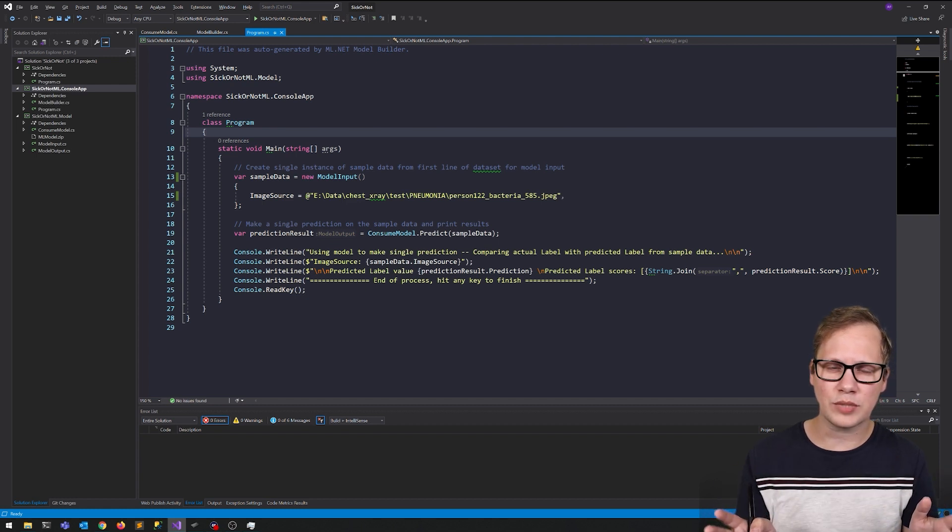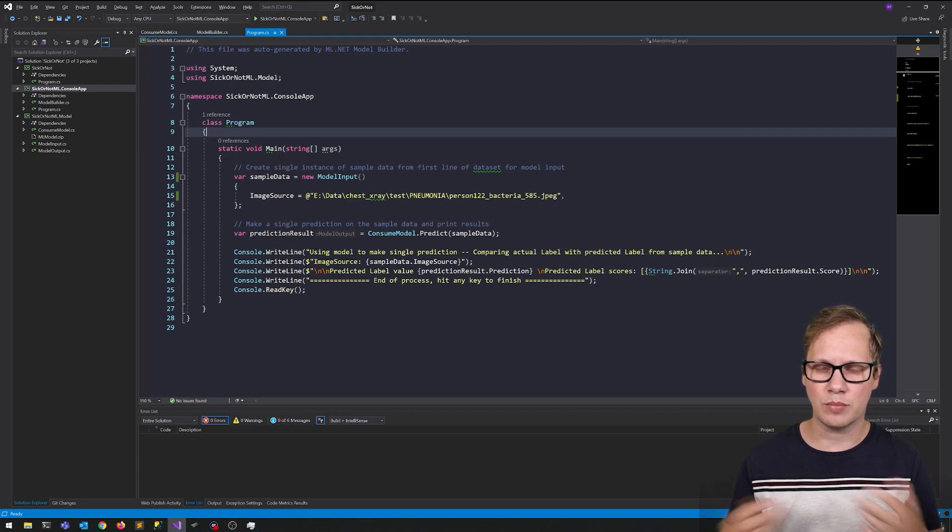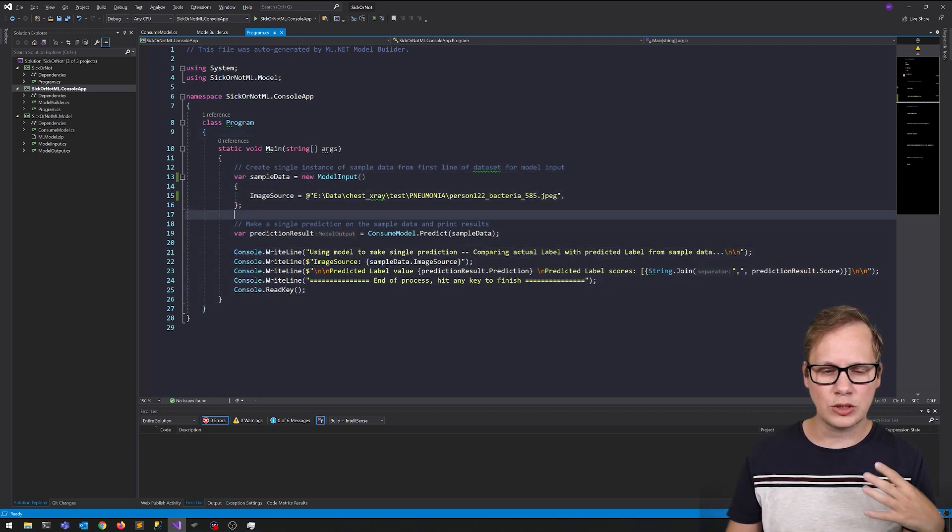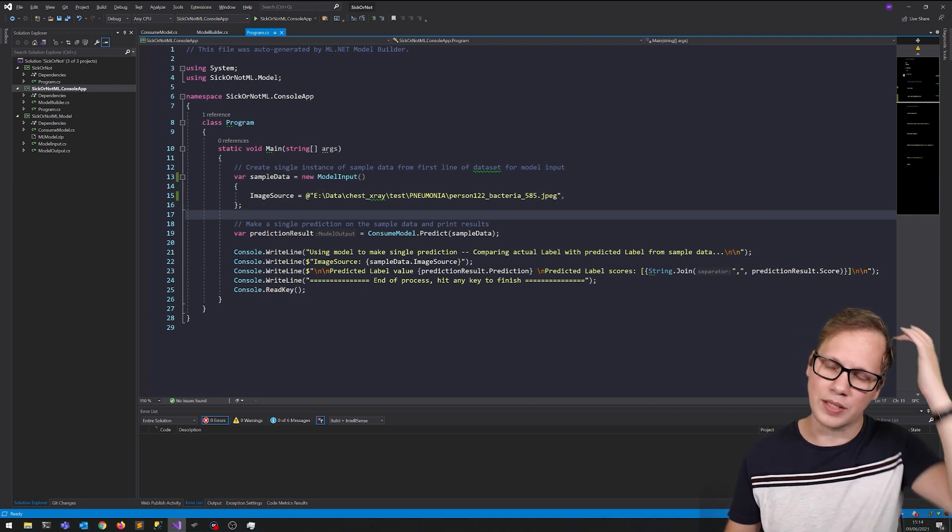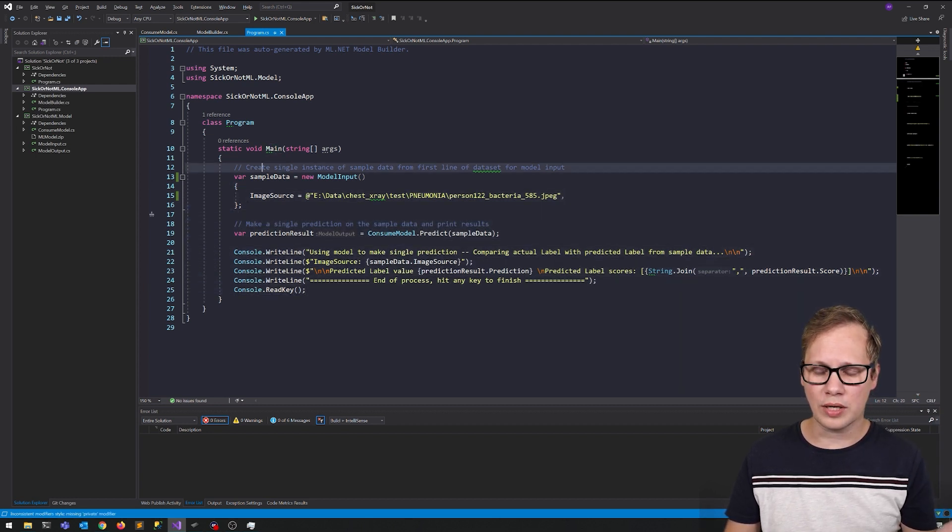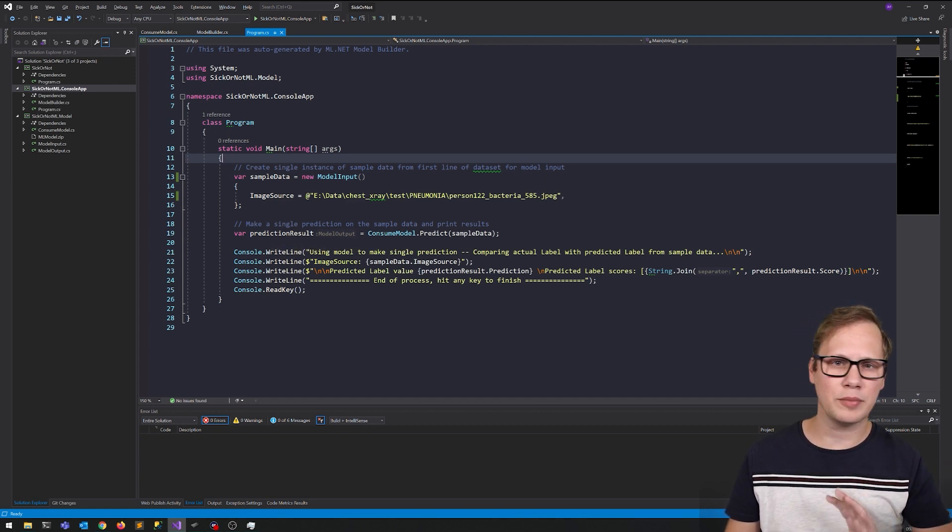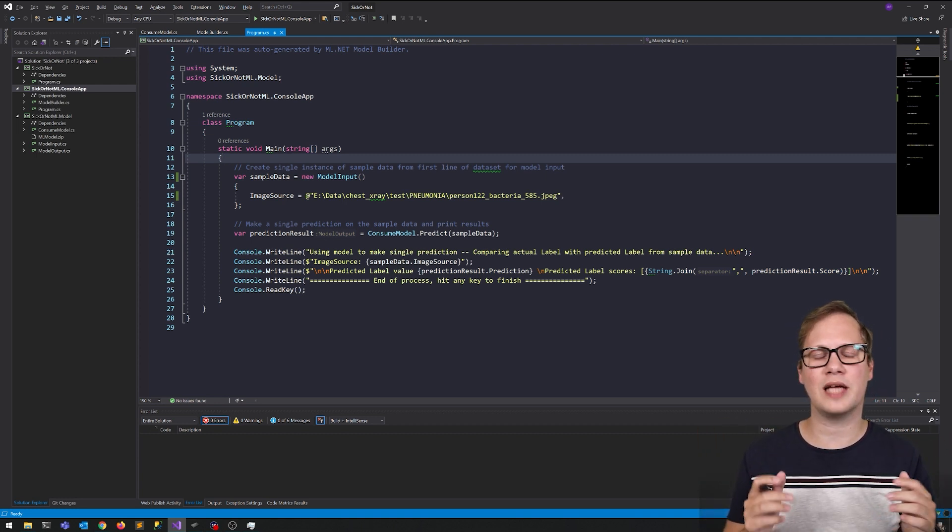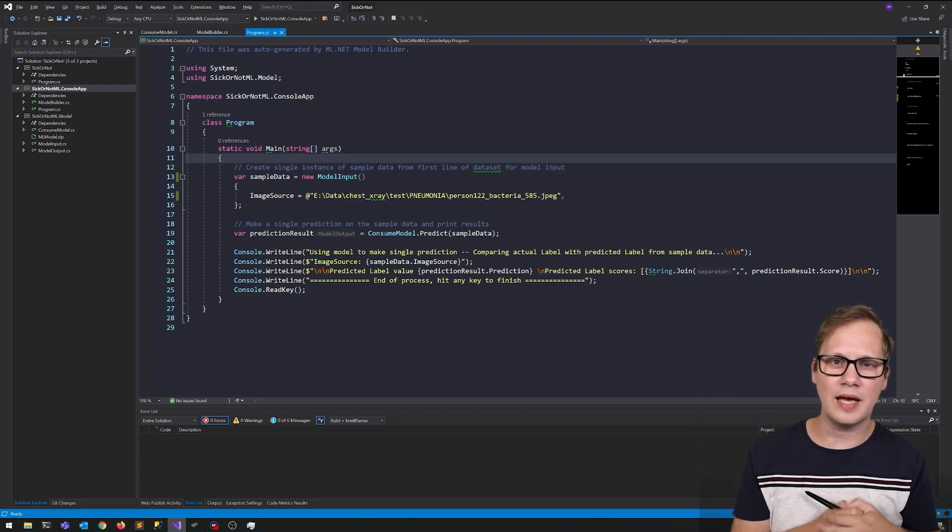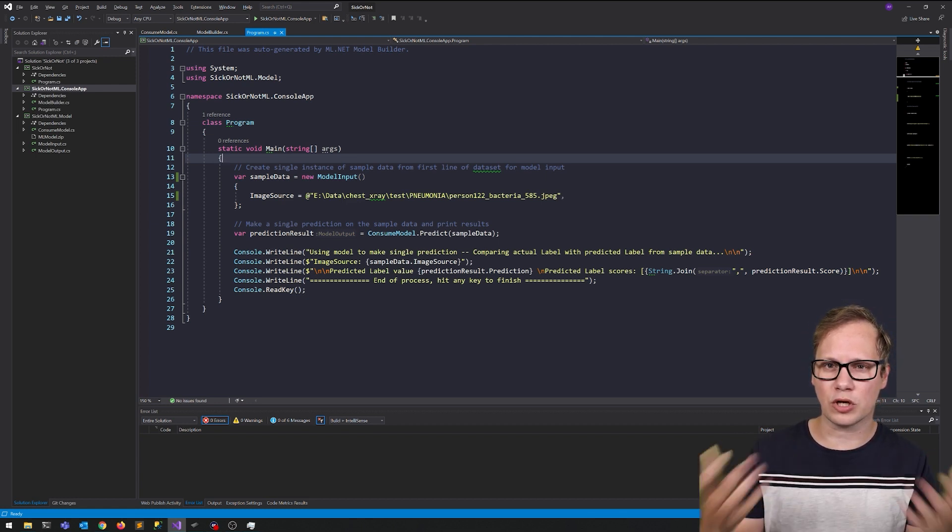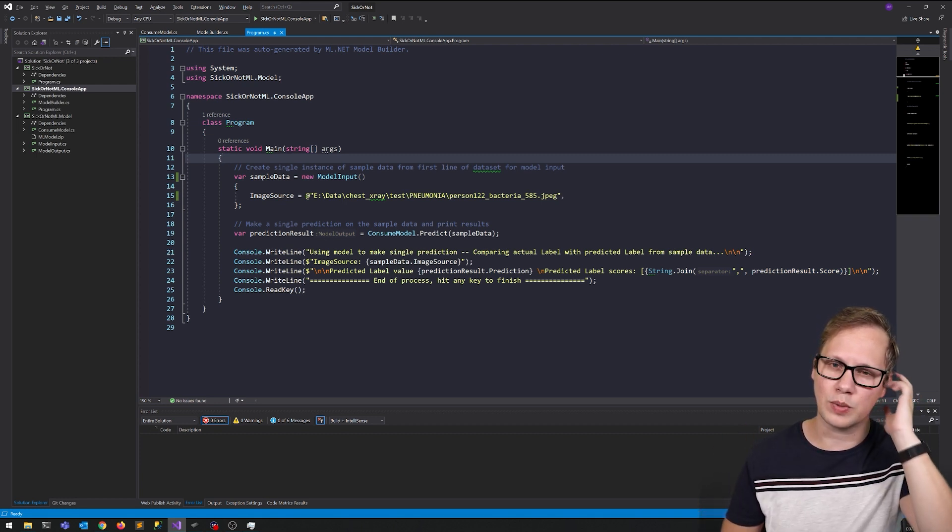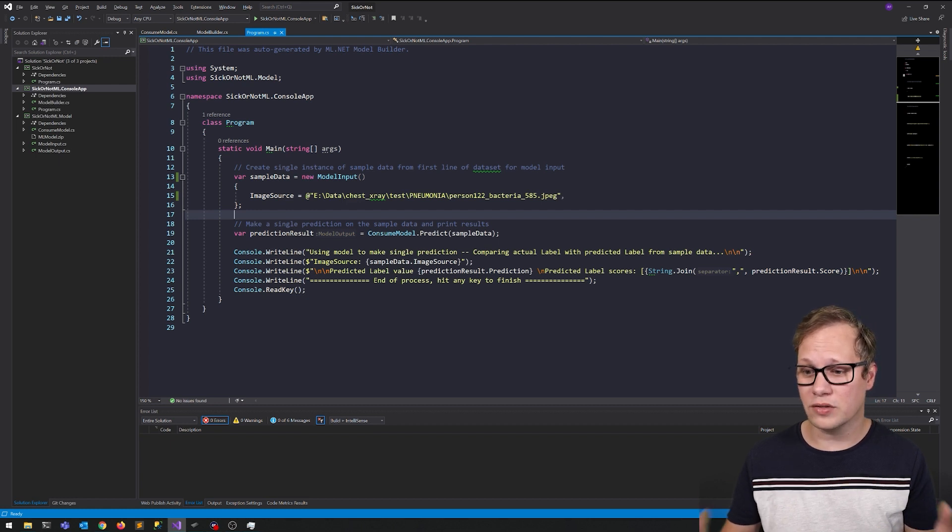And of course, you can set a limit to the confidence level and you say, if it's 99% confident, then I'm just going to take it as it is. And then this is a case of pneumonia. If it's not 99% confident, then someone from radiology will have to take a look and inspect the X-ray himself in person. But yeah, this is it. And I think this is really cool because this way machine learning becomes accessible to people that don't have a lot of experience with machine learning, but do know how to program in C-sharp because I can use this code and put this in ASP.NET Core app and just make it a web interface or use this console application to pick up a file automatically and put a value into as soon as the X-ray is shot.